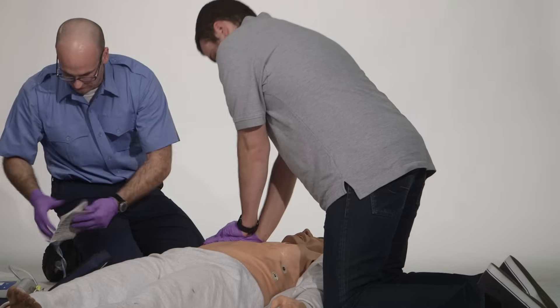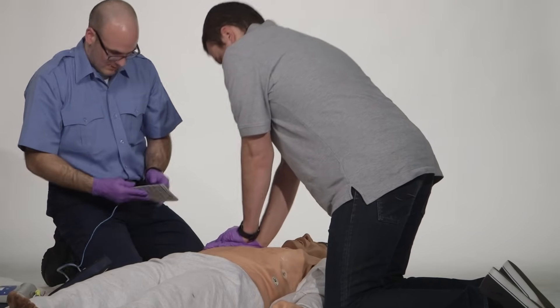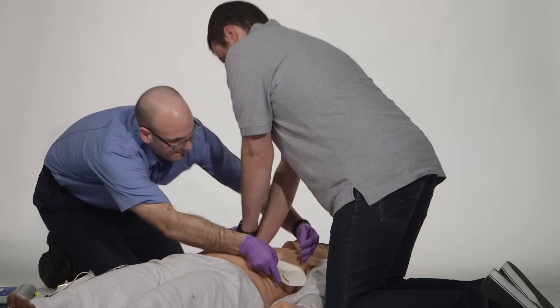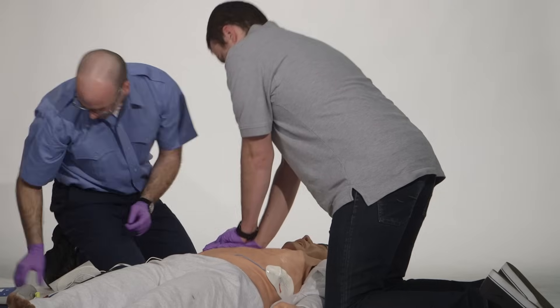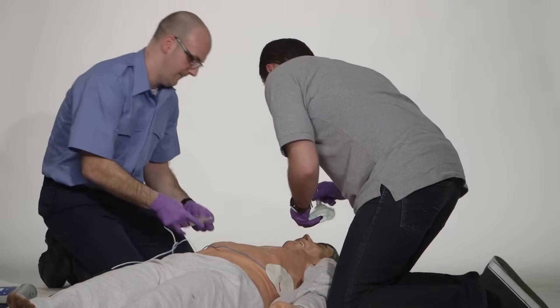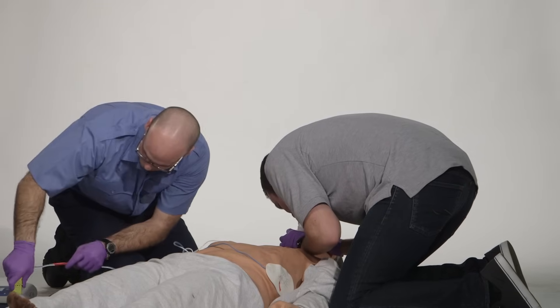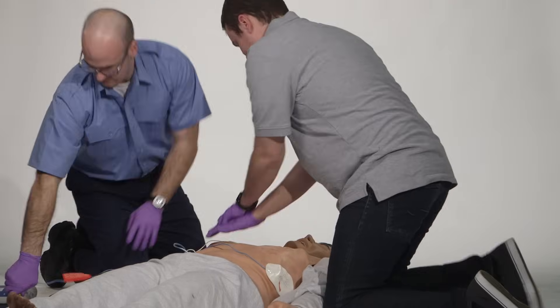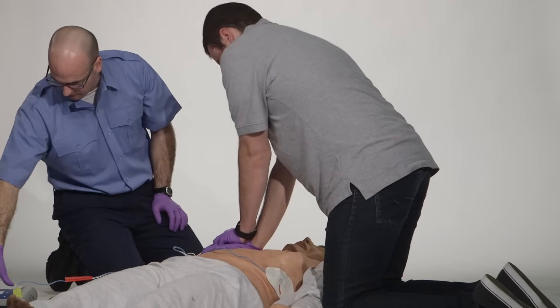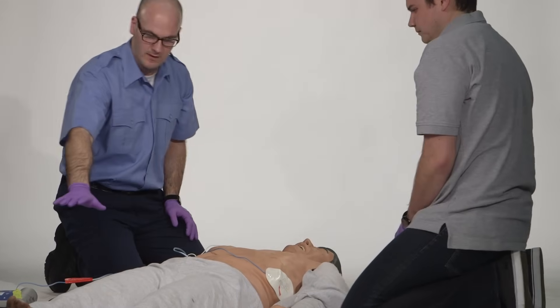While my partner is continuing CPR, I will turn on my AED. I will attach the pads to the patient. Apply pads to patient's bare chest. Plug in the pads connector next to the flashing lights. Make sure everything is hooked up correctly. Analyzing algorithm — clear the patient.